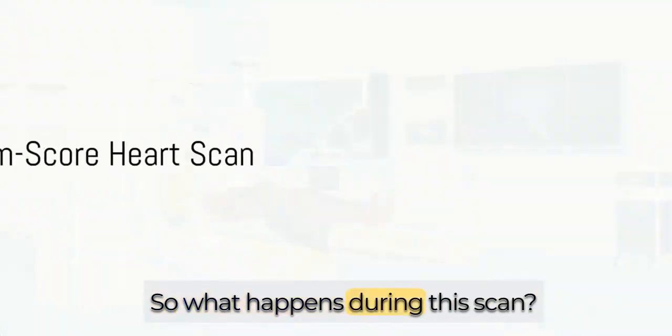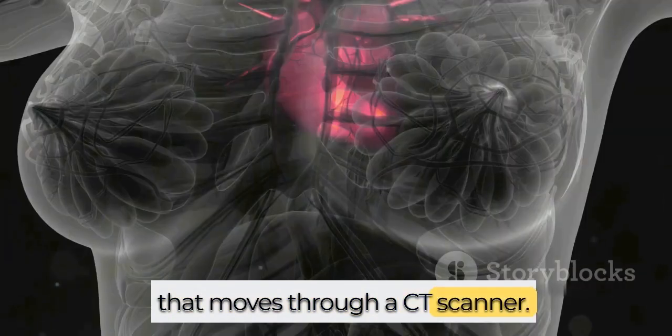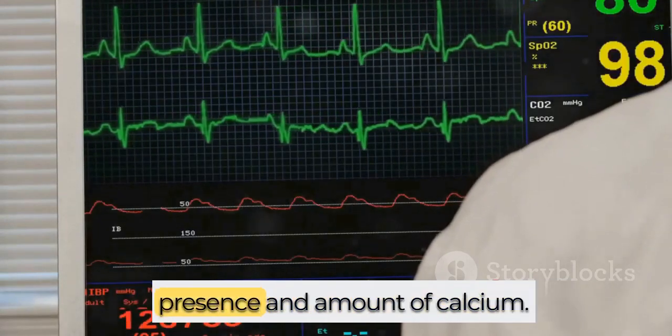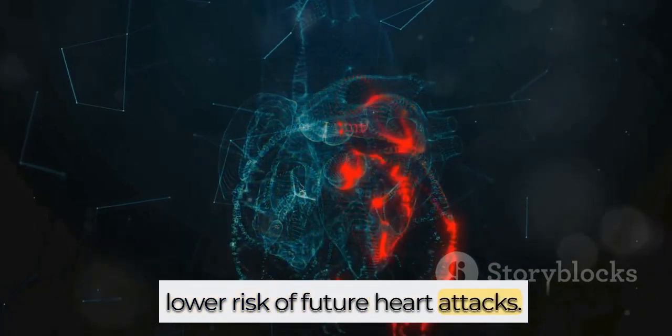So, what happens during this scan? The patient lies on a table that moves through a CT scanner. The scanner captures images of the heart when the muscles are relaxed. The resulting calcium score indicates the presence and amount of calcium. A score of 0 suggests a lower risk of future heart attacks.